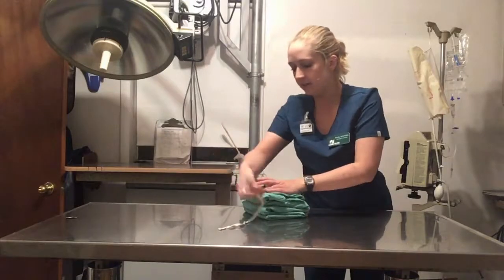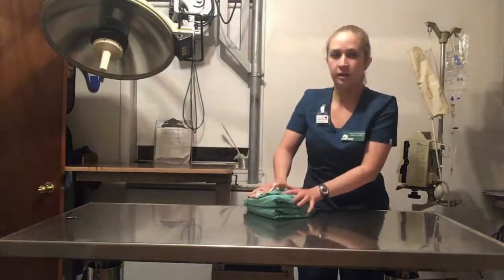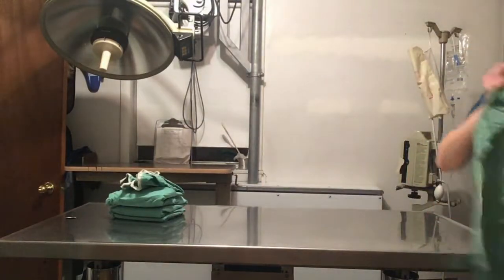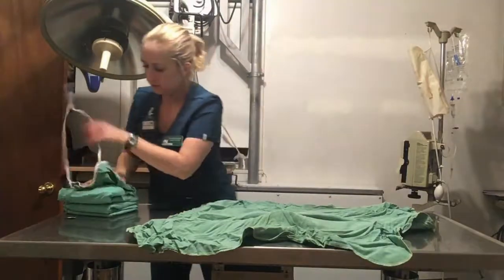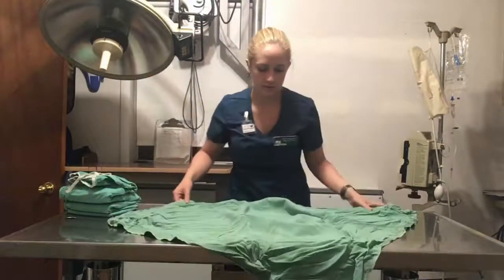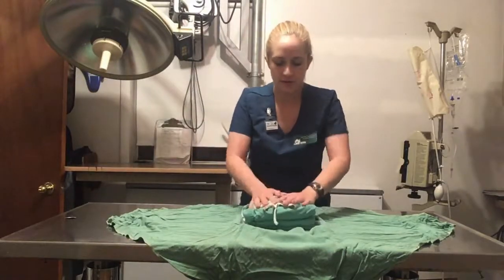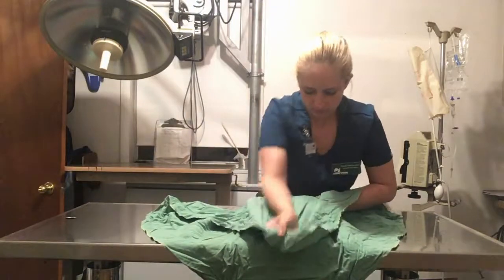Alright, and now this is at top, and you're going to leave these right there on top, ready for the doctor to take them out to keep it sterile. So once you do that, you're going to take your wrap and lay it out. And then you're just going to wrap it like any other wrap with the envelope fold. So you're going to get this in the middle. Pull it tight.